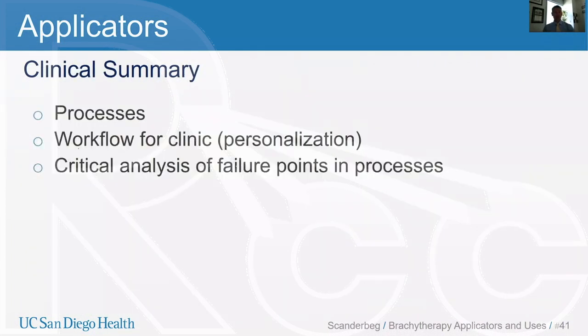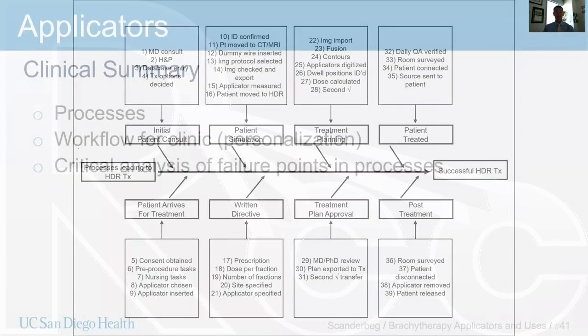So we'll just finish up with a quick summary of the clinical workflow for gynecological HDR treatment, including the processes involved. So the next slide shows an example of a chart diagram of the processes involved in an HDR brachytherapy treatment.